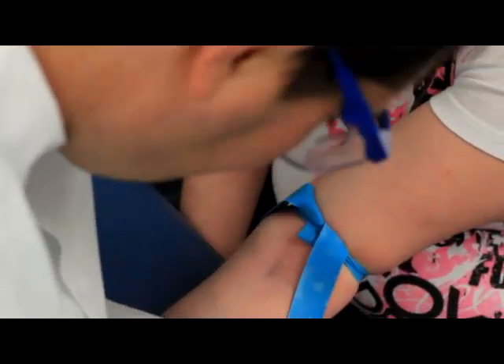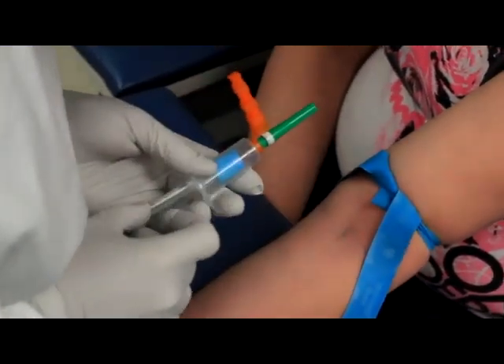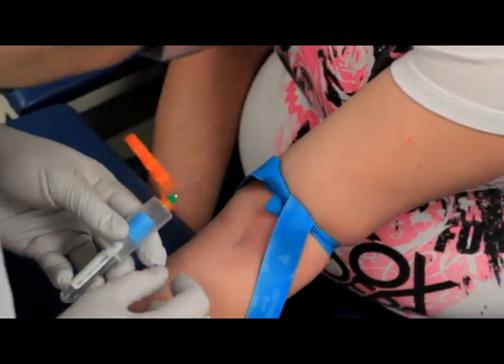After your equipment is assembled, reapply your tourniquet, being careful not to contaminate your draw site. Remove the cap from your needle and check that the bevel of the needle is facing up. Position the needle safety device so that it is not in your way.